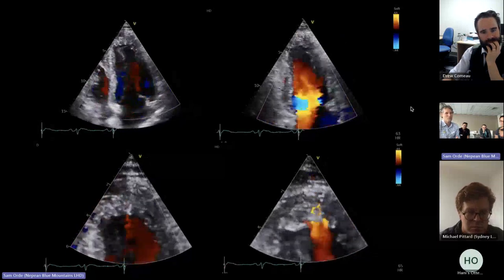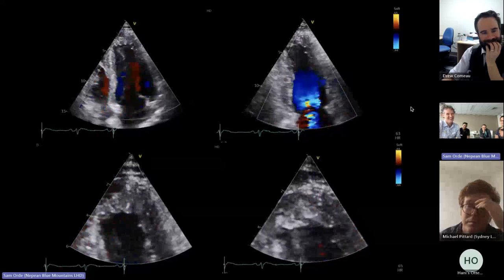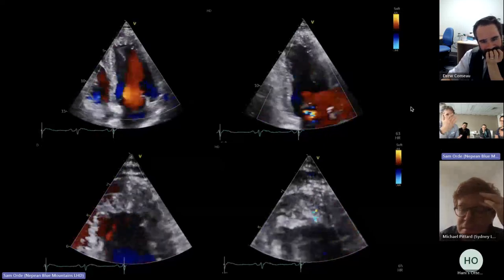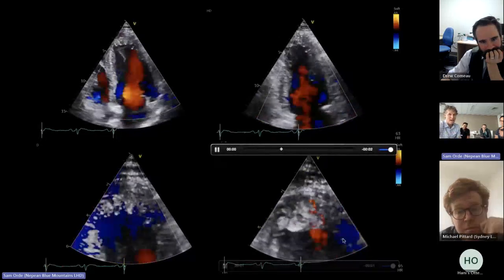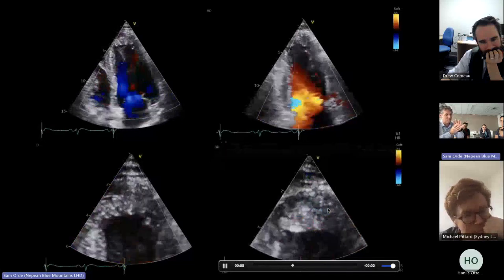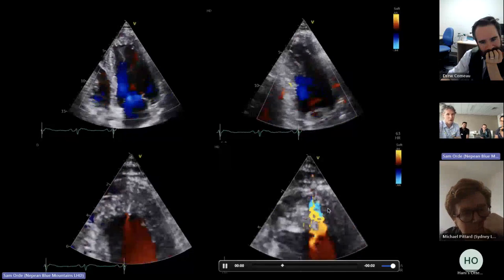This is what Faraz calls poor man's contrast. So with poor man's contrast, you use color Doppler, reduce your scale, and get your focal position up where you're interested, near the apex, and you try and see if there is a bleed of Doppler over the structure. Are you looking at a real structure? Is it an artifact?